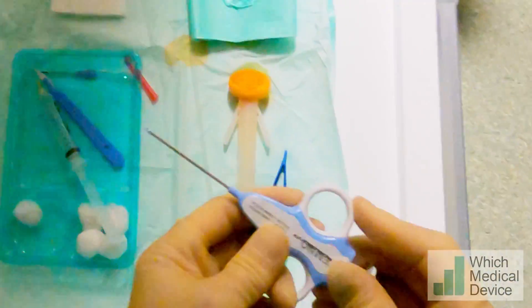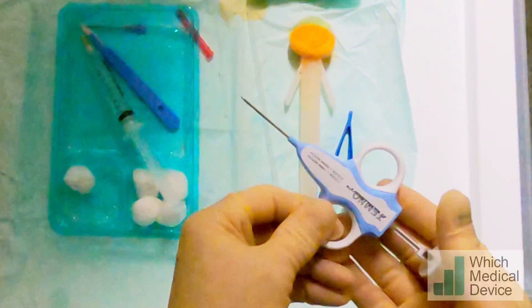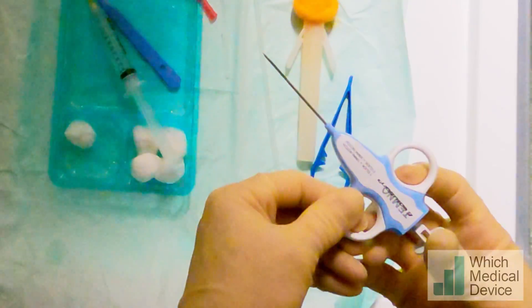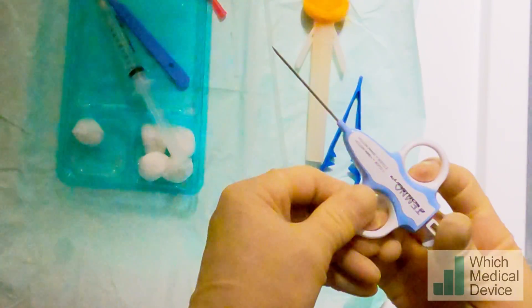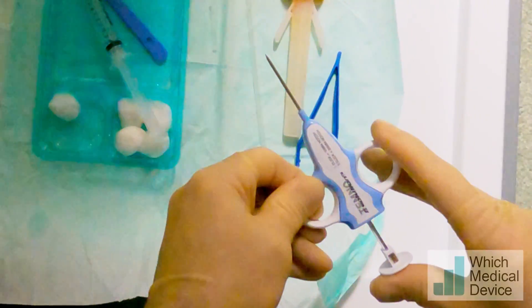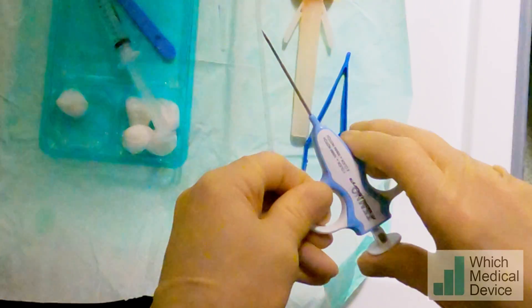So this is a 14-gauge by 6-centimetre Temno spring-loaded biopsy device and it allows you to control the forward movement under direct vision with ultrasound, and then it fires in that direction. So once it's gone forward to there, it doesn't go forward anymore beyond that point, which means if you've got any deeper structures you're less likely to damage them when you actually fire.